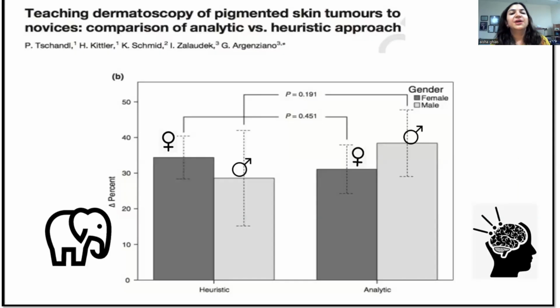So now you have studied two important patterns of diagnosing the dermoscopic images. One was pattern analysis, where you went stepwise, looking at the structures and their arrangements and their colors. And the second method was a one-point checklist or elephant approach, in which you were shown so many elephants. Okay. So there was an interesting study that was conducted on medical students, and both these methods were taught to them, the analytical method of interpretation of dermoscopic images and obviously the elephant approach.